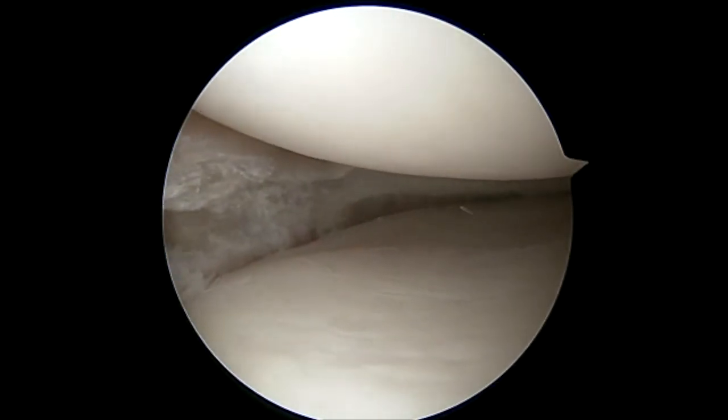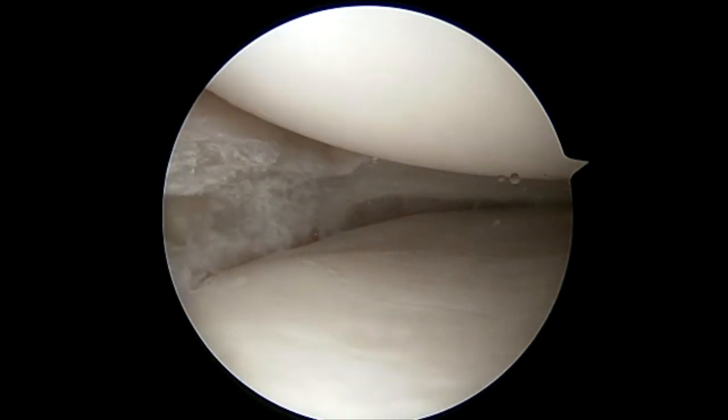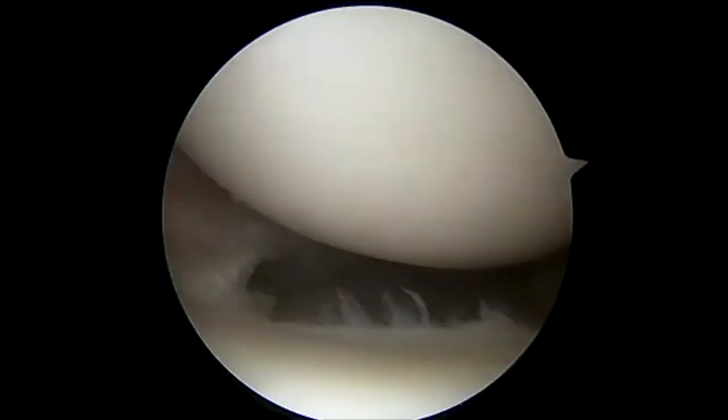After we evaluate this, especially in the medial compartment, we trephonate the MCL. This allows for easier passage of sutures later on and has no long-term effects on the MCL.